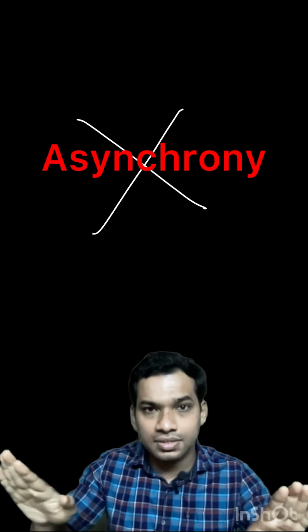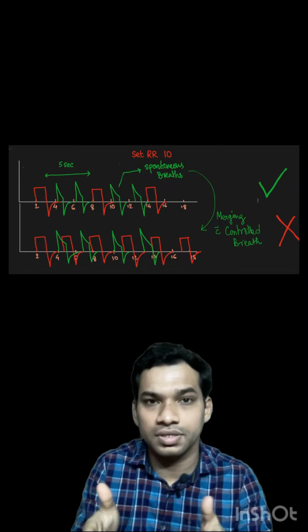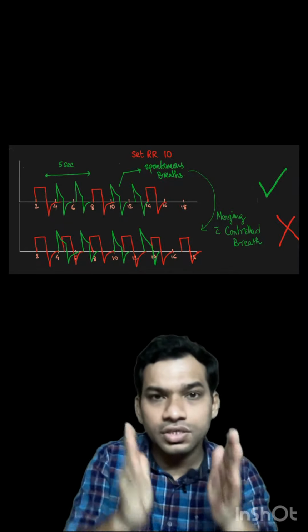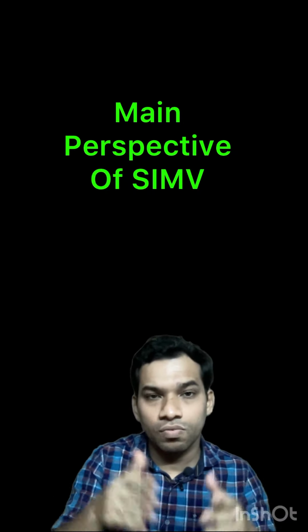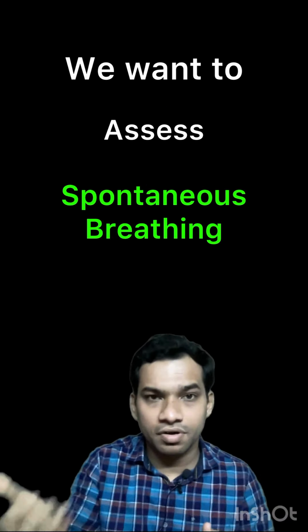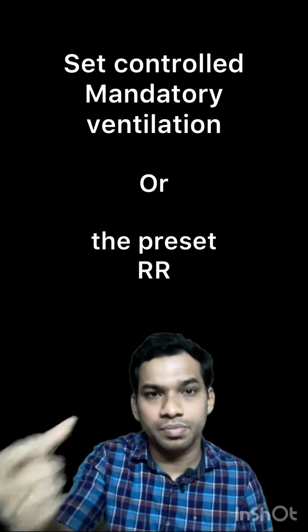Hence, these control breaths need to be wide apart and give adequate space so that these partially supported spontaneous breaths can happen properly without asynchrony. So this should be the main perspective when we put a patient in an SIMV mode from assist control, where we are trying to assess the spontaneous breathing effort of the patient in the backdrop of a safety ventilation provided by the set controlled mandatory breaths in an SIMV.